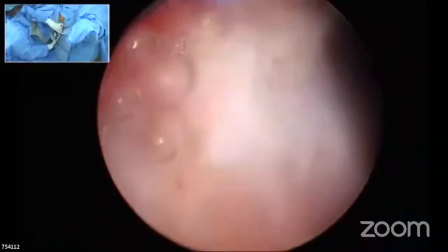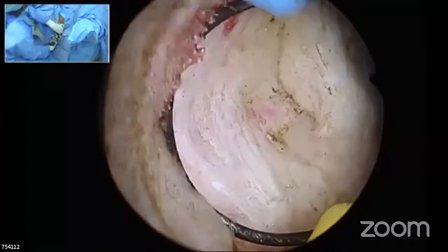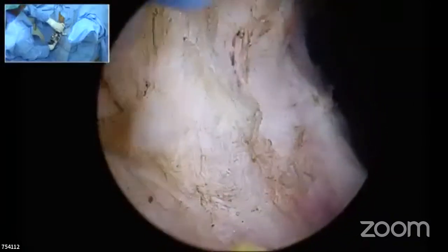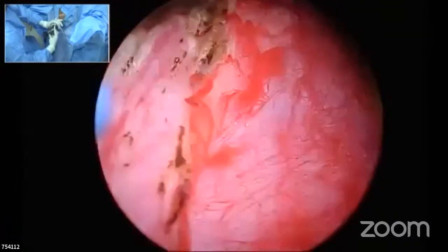Okay, anyway, that's not the point. But do you want to see? That's why I did it. I have a habit of fixing it all the time. So I reach the capsule here. You can see the capsule. I reach the capsule at the 11 o'clock position. Now I see this is the lobe.